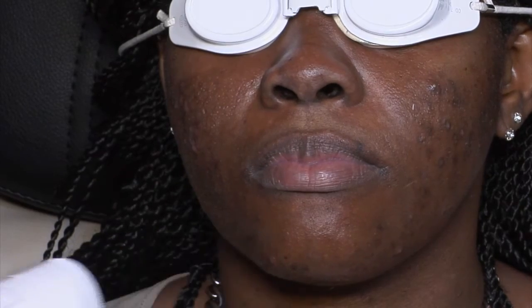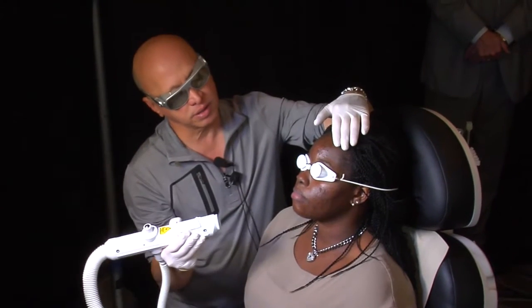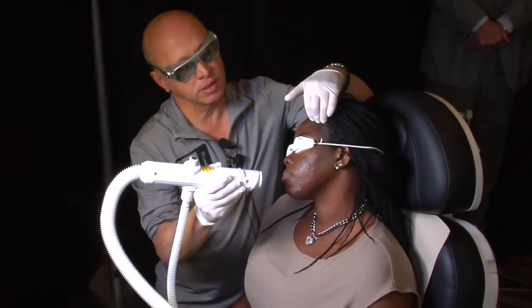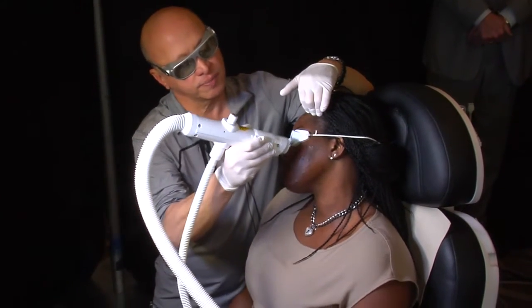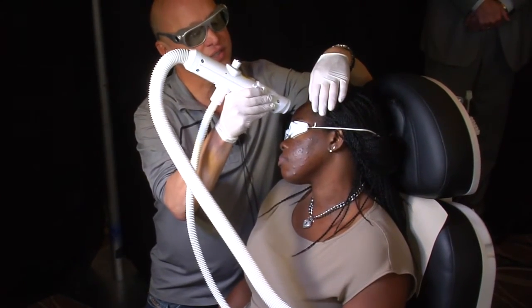Pulse stacking in general is bad — just remember that. Especially when you're talking about CO2 and things like that, it's bad. In certain aspects, we can use it for the benefit, and that's what David's doing here. So just understand it.